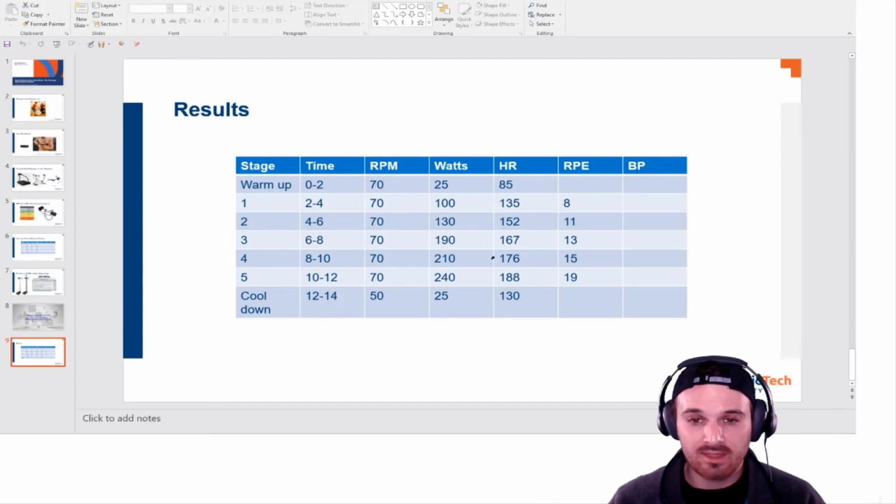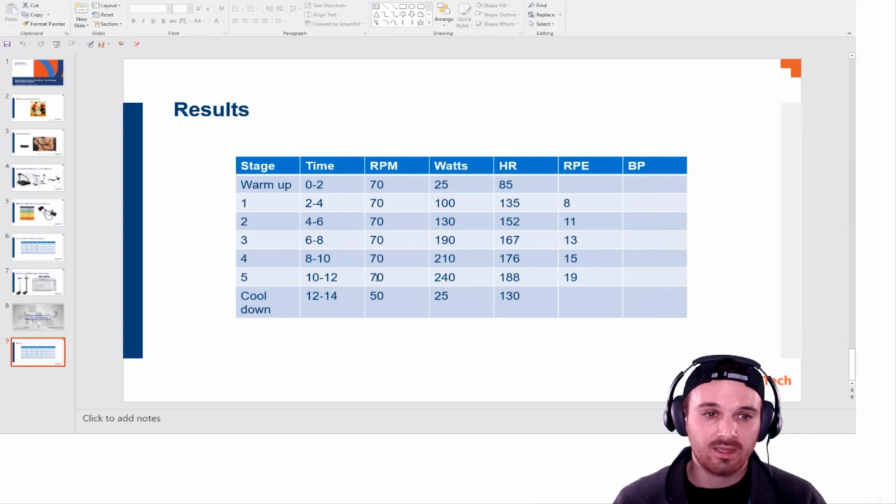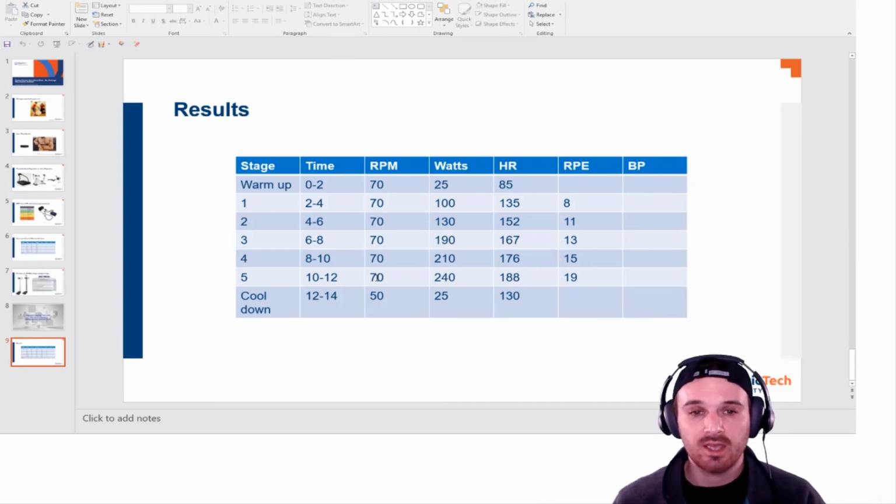So then you can take that workload and heart rate, and either put it into a predictive equation if you used a previously published test with an equation that goes along with it, or you could plot it into Excel and then extrapolate and find that final data point and then map that out to VO2 based on normative data. So yeah, that's pretty much exactly how that goes.